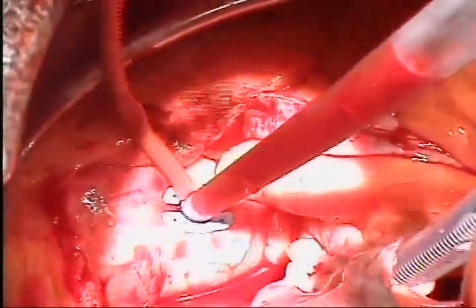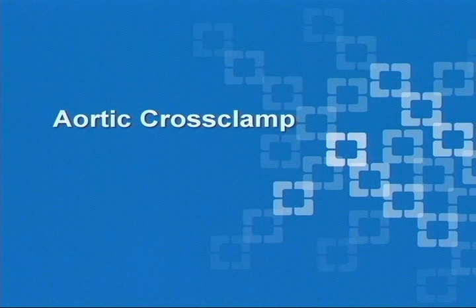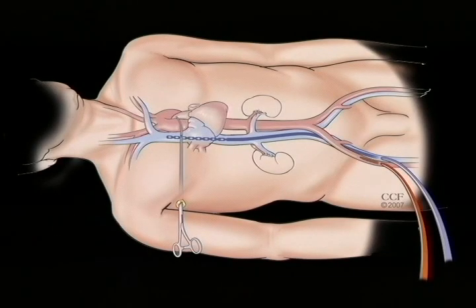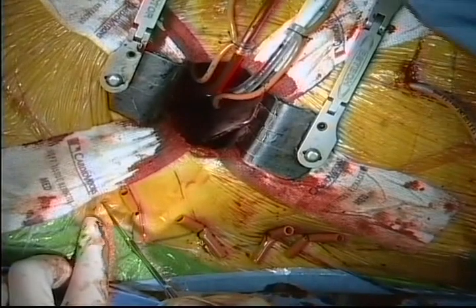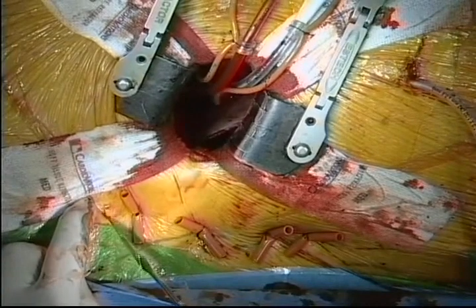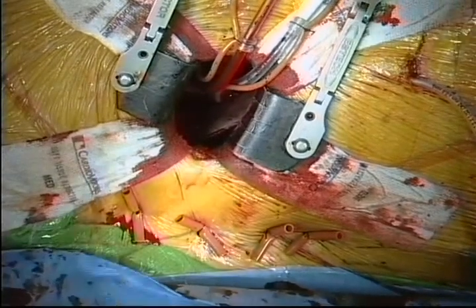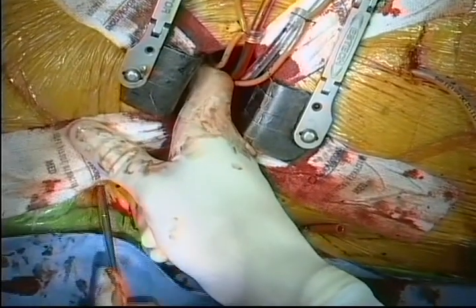Additional myocardial protection is achieved by systemic cooling to 30 degrees. The aorta is cross-clamped using the Chitwood transthoracic clamp. As illustrated here, this is placed in the anterior to mid-axillary line, generally in the third intercostal space. A small stab wound is created in the anterior axillary line in about the third intercostal space. The chest is entered using a tonsil clamp, taking care that the clamp enters the chest just above a rib in the appropriate intercostal space.